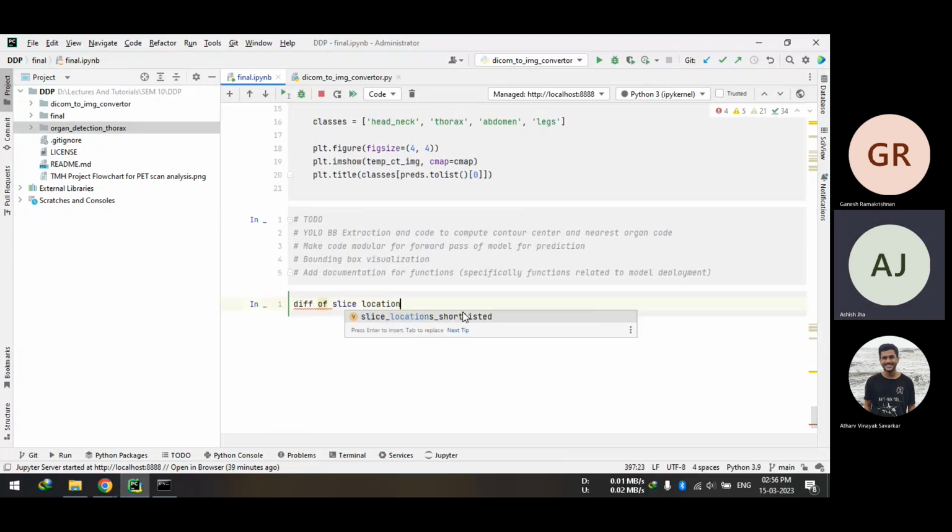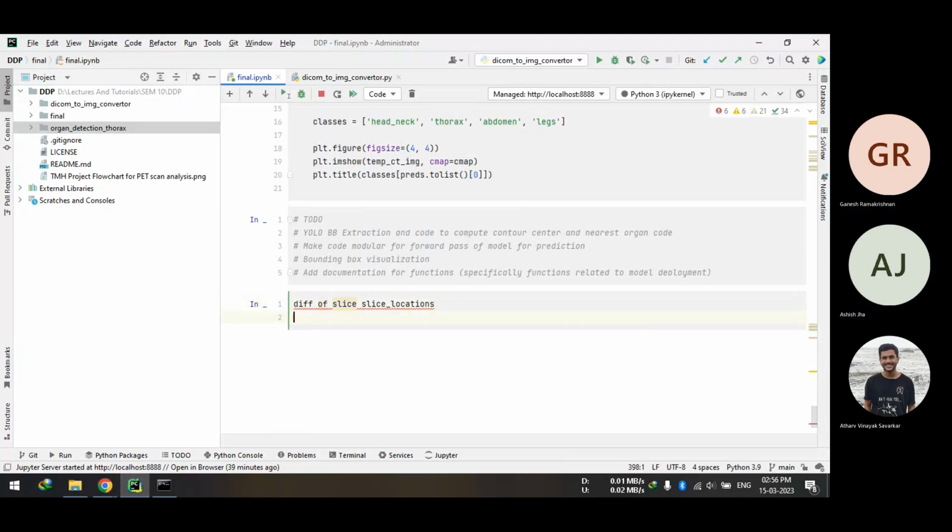XY. You have X and the number of pixels you have. You multiply that and you will find the volume. That is called voxel. What is the X and Y dimension of a voxel? No, you need not find that X and Y dimension. You need to find how many are in your original image, by the matrix size.